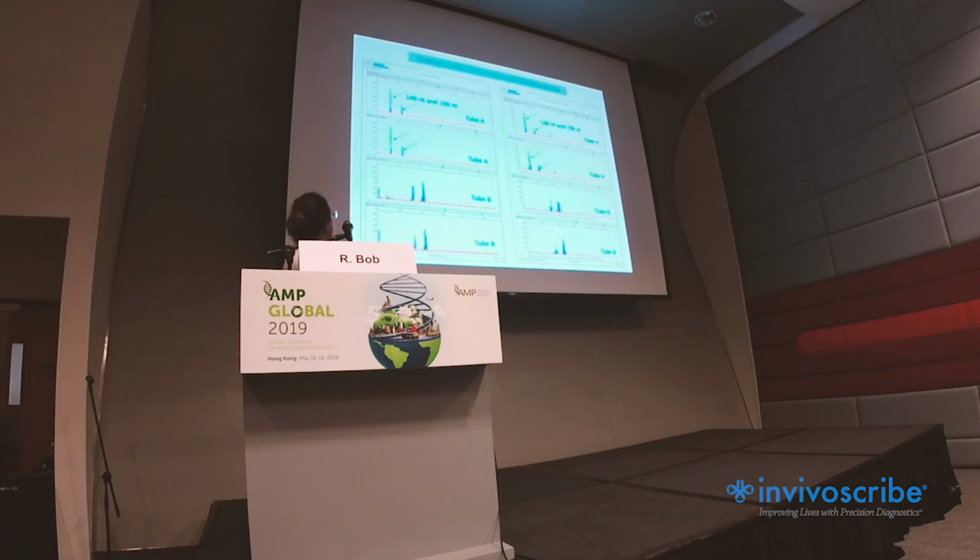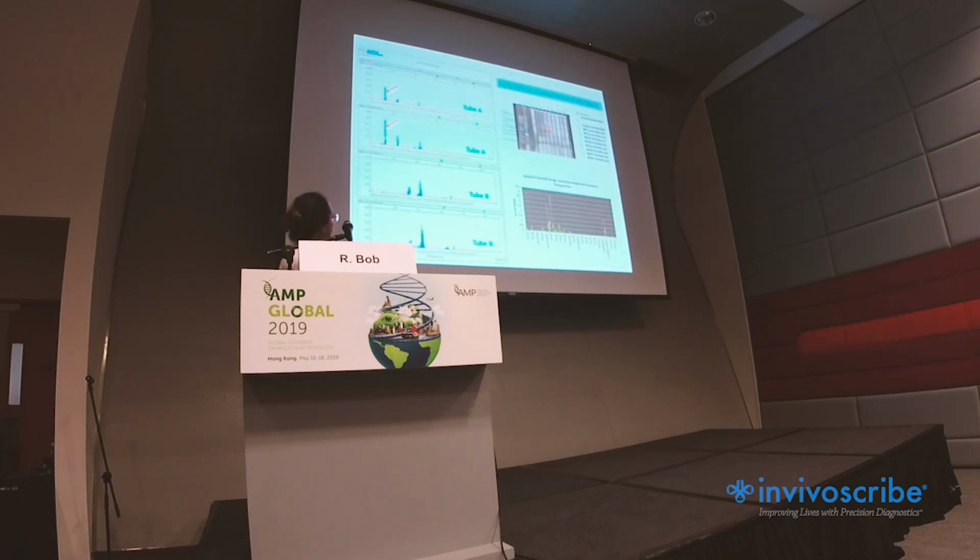And here in these two cases, I wanted to show you, look at case 1 and look at case 2. I come to heteroduplex electrophoresis of case 1. This is our monoclonal positive control. This is our polyclonal control. And you see that the duplicate heteroduplex electrophoresis for these two tubes are polyclonal. So that's a polyclonal peak. And this is the NGS analysis. It shows also a polyclonal result.